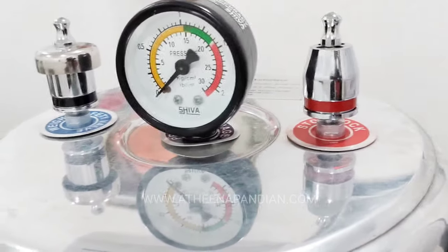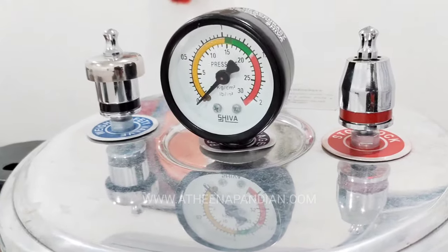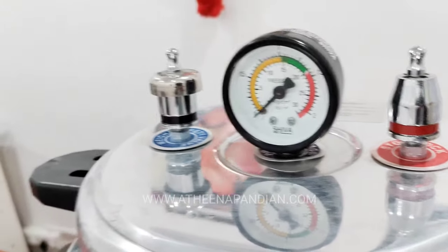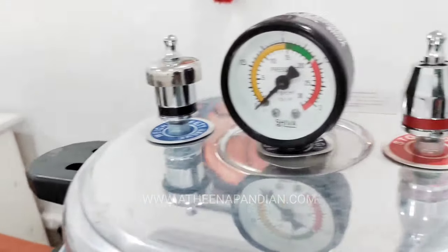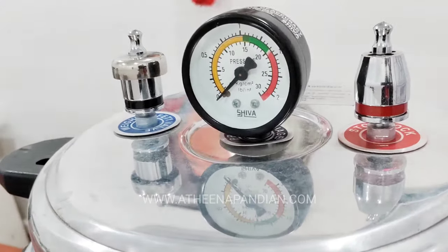The normal pressure will be maintained by the stop cock valve. If there is high pressure which cannot be handled by the stop cock valve, the weight safety valve will act to release the pressure in addition to the stop cock valve, to avoid the bursting of the autoclave.